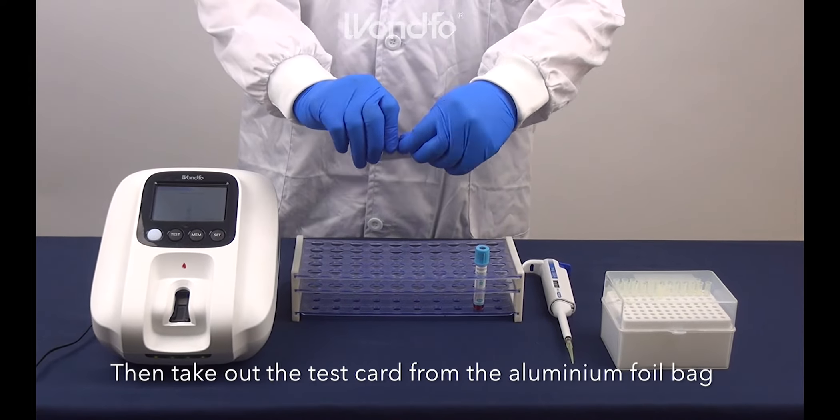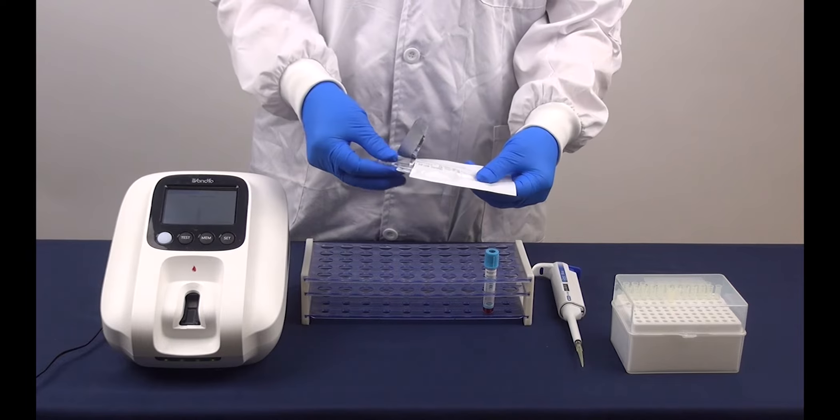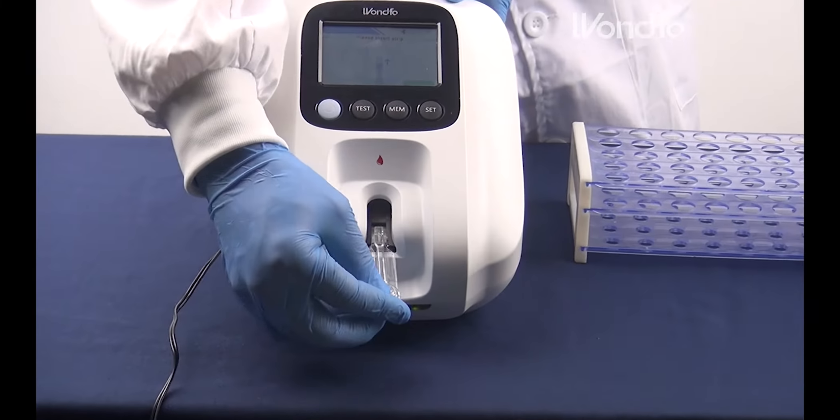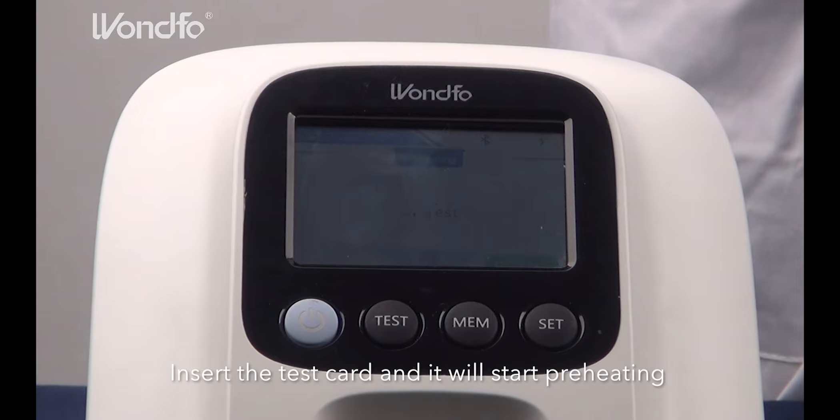Then take out the test card from the aluminum foil bag. Insert the test card and it will start preheating for 25 seconds.